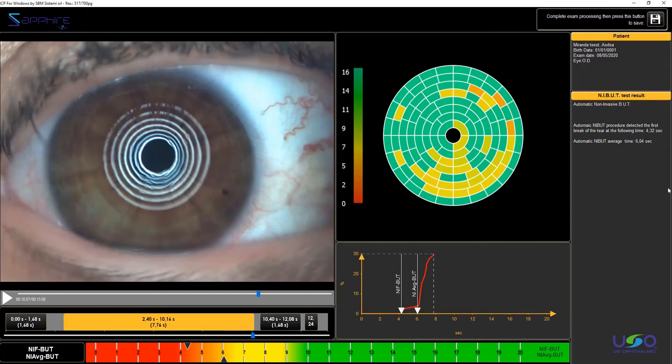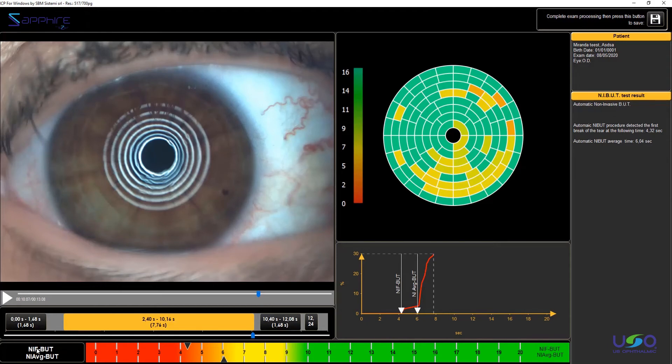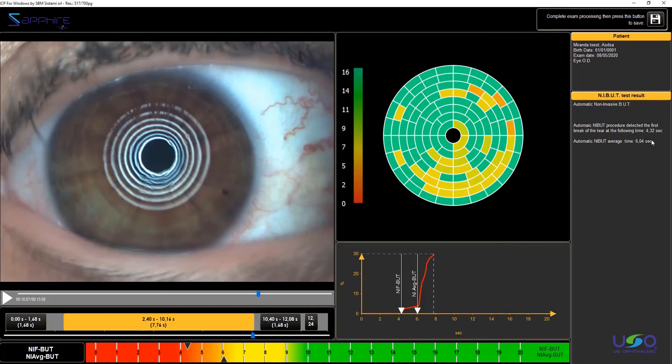Anyway, the two most important parameters we are going to look for are these two indicators over here: the non-invasive first break-up time, which is 4.32 seconds, and the non-invasive average break-up time, which is just a bit more than 6, 6.04 seconds. So the value we really need is the 6.04, which is the average break-up time value.